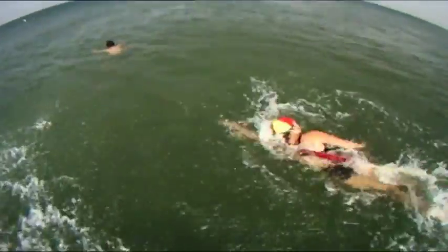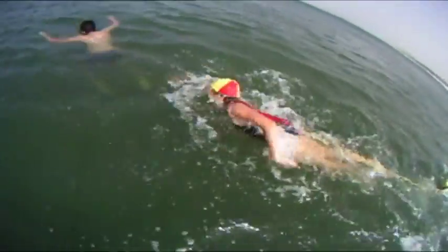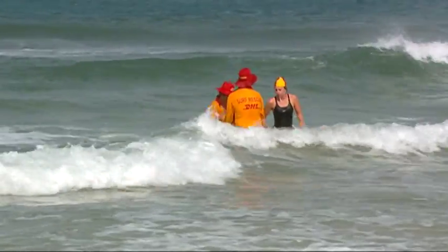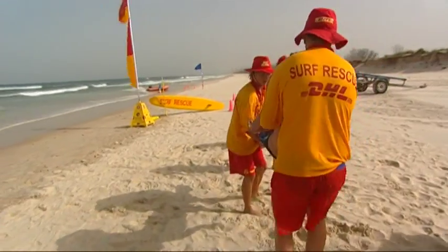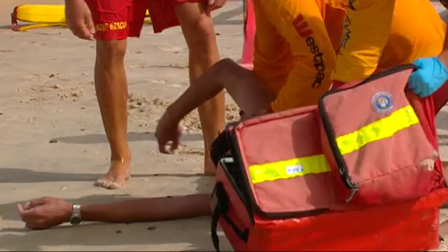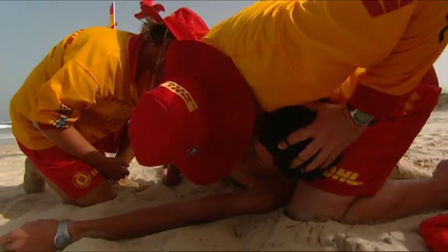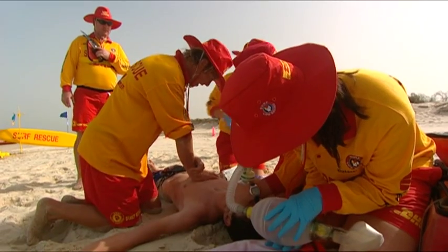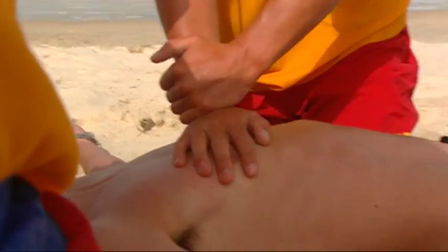Defibrillator. The automated external defibrillator, or AED, is used when a patient's heart has stopped beating or is beating weakly or irregularly, that is, cannot generate a pulse. This device sends an electric shock through the chest to enable a heart to resume a functional heartbeat and should be applied as soon as possible. A trained operator is the only person that can operate the defibrillator.